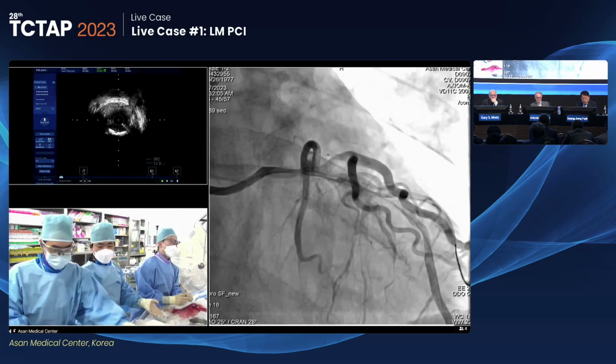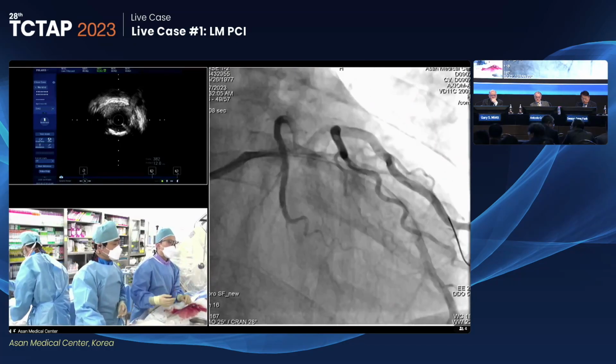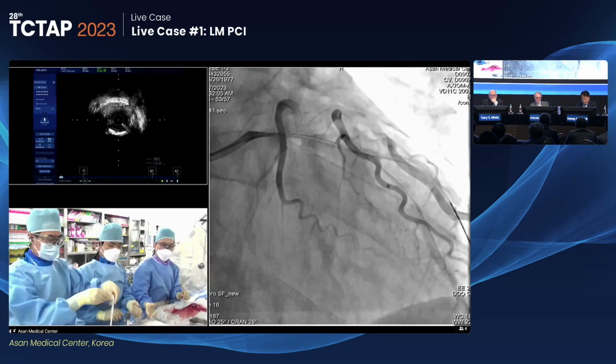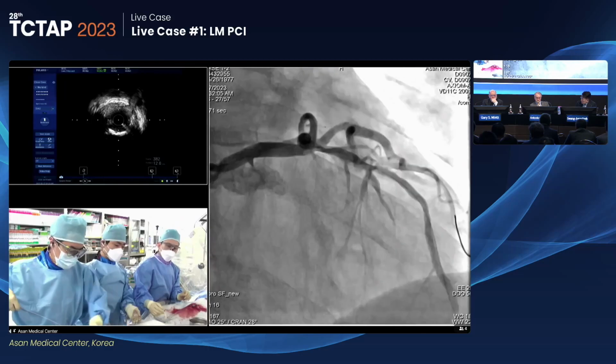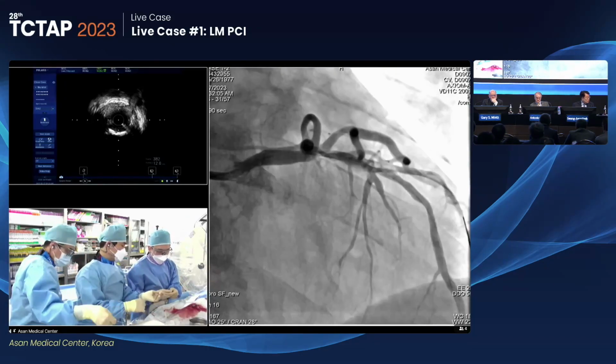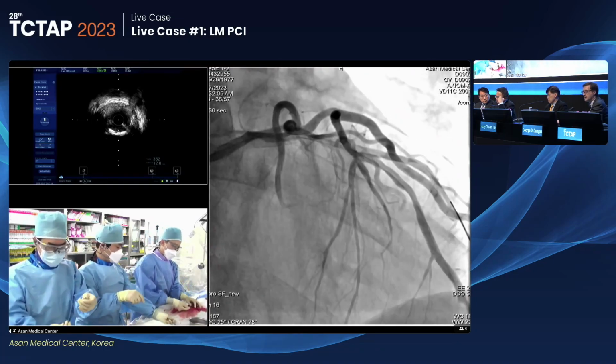I wonder if we need to do a cutting balloon or something in the diagonal ostium. I think he dilated it already. It's a big diagonal. We need to really have a very good result there when we go with this very long stent, because after the stent we're mostly focused on the ostium, and I think we should secure the diagonal a bit better.